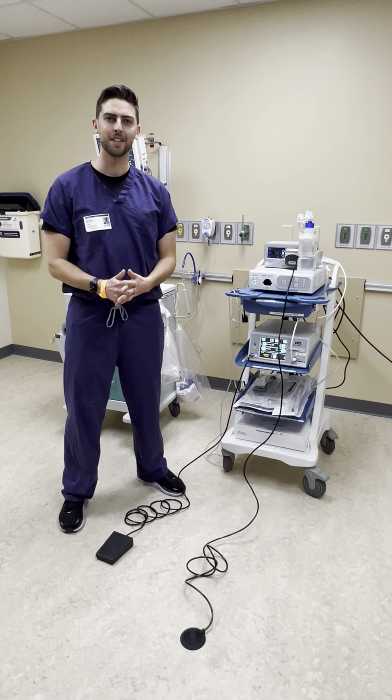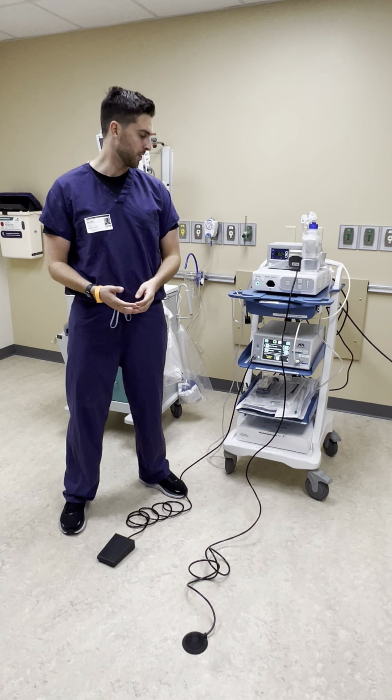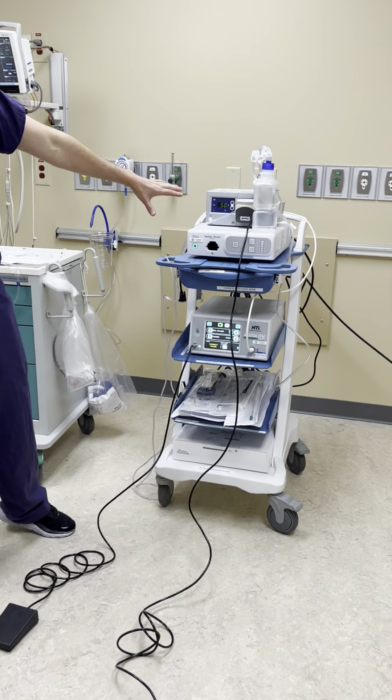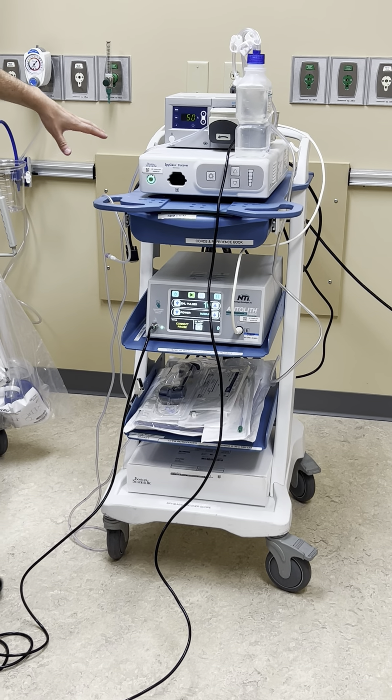Hey everyone, I'm Ethan with Boston Scientific. I'm going to go over the SpyGlass Discover choledochoscope. The first thing you're going to do is find the cart. All of your items should live on this cart together and it is labeled as well.